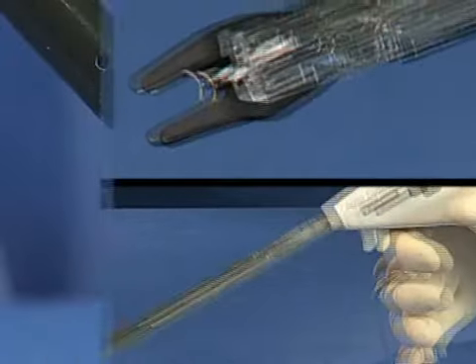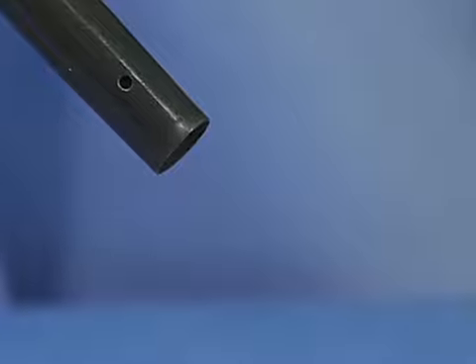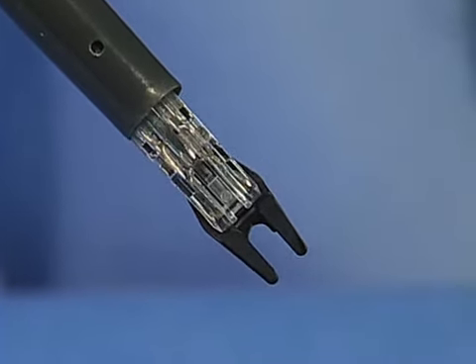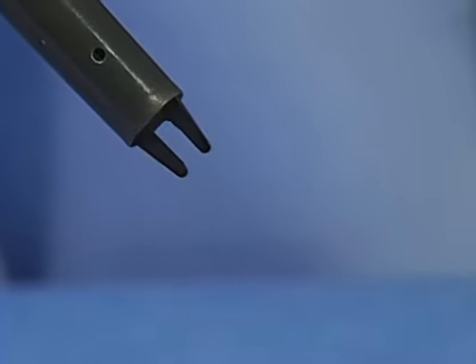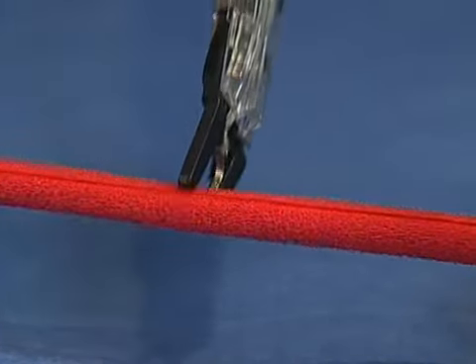Note, the appliers should always be introduced or removed through the trocar without a clip in the jaw. Introducing a device with the clip in the jaw may make introduction difficult and could result in a malformed or dislodged clip. To ligate a vessel or structure, place the instrument jaw around the object.